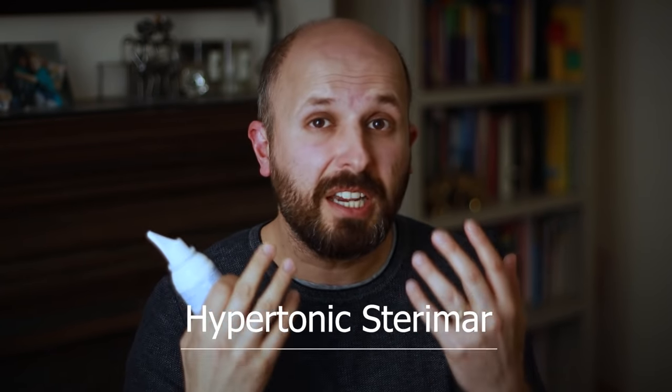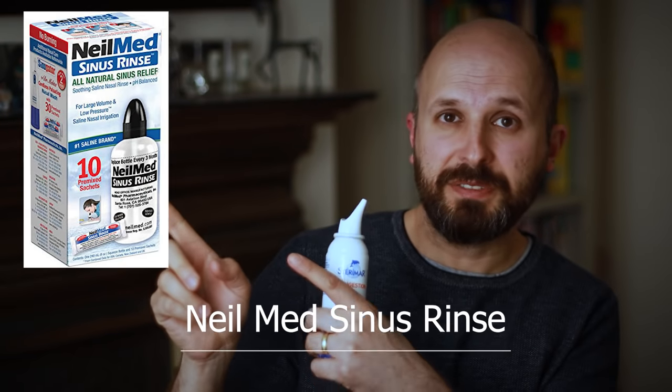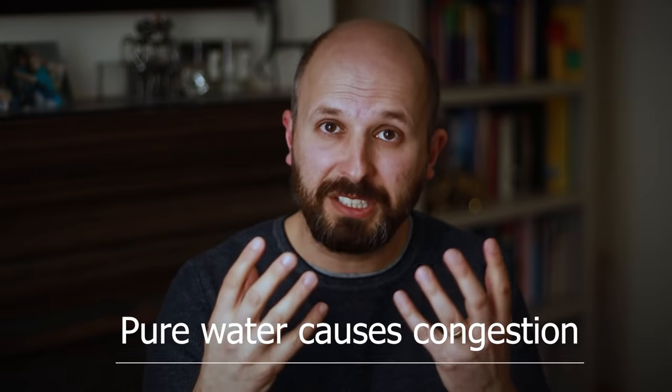Tip number two: if you're going to spray these sprays up your nose, you need to make sure the spray actually touches the lining of your nose — it doesn't touch the mucus or debris inside your nose. I recommend you clean out your nose using some salt water or a hypertonic saline such as Sterimar. If you've got sinus problems, use Neilmed sinus rinse. Use salt water to flush out all that mucus so when you spray it, it sits on the actual skin — not on the mucus — because you're trying to treat the lining, not the mucus.